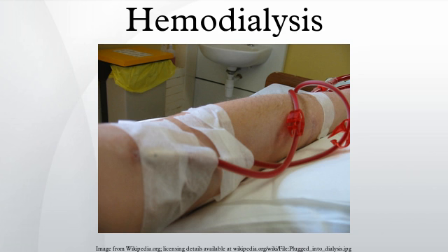KoA, expressed in milliliters per minute, can be thought of as the maximum clearance of a dialyzer at very high blood and dialysate flow rates.